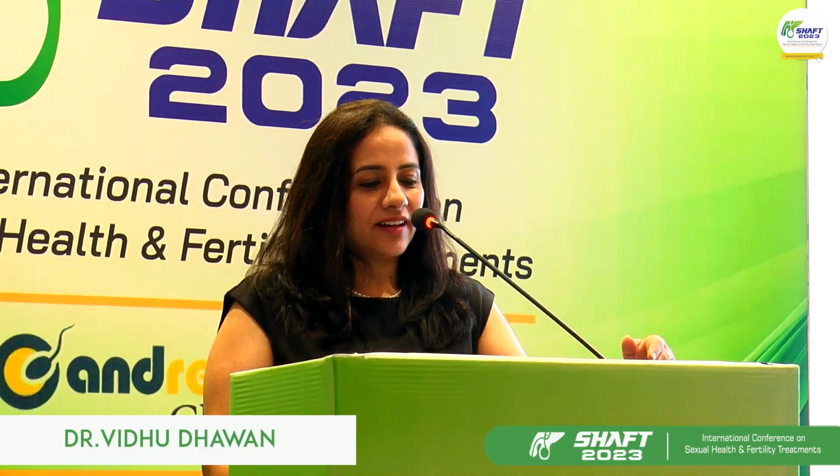Flow cytometry is for the measurement of the ROS measures. This is a little detail of all the tests. Actually, it would go a little off the purview of the assessment of this talk today. But I would certainly want to talk about the various advantages and disadvantages of the same.